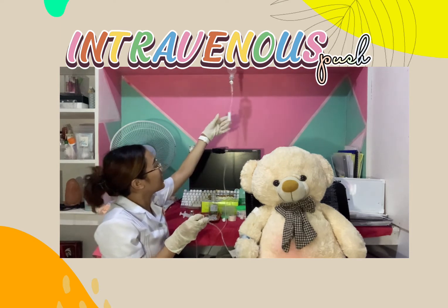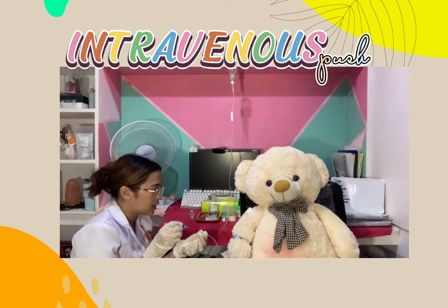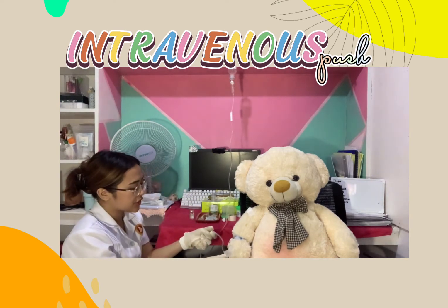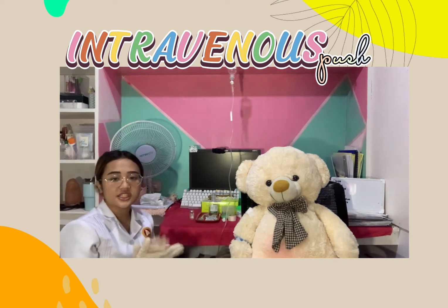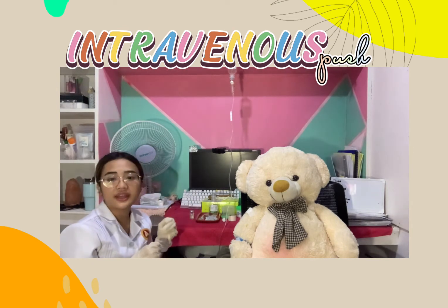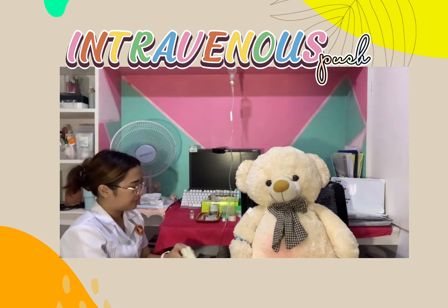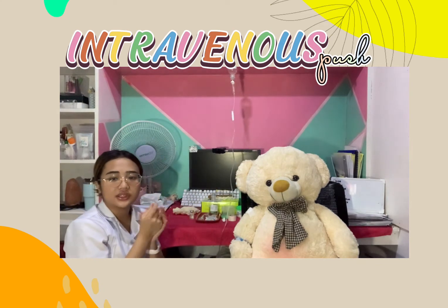We will open the clamp, and then we will slowly remove our syringe, and then we will dispose it. And then after that, we will just make sure that the medication is already administered to the patient. And then after that, we need to dispose all of the equipment that needs to be disposed. And then we need to remove our gloves. We need to perform hand hygiene and any infection control technique.